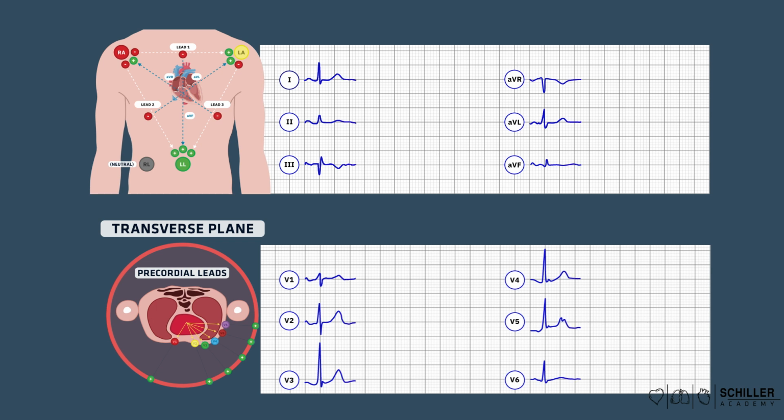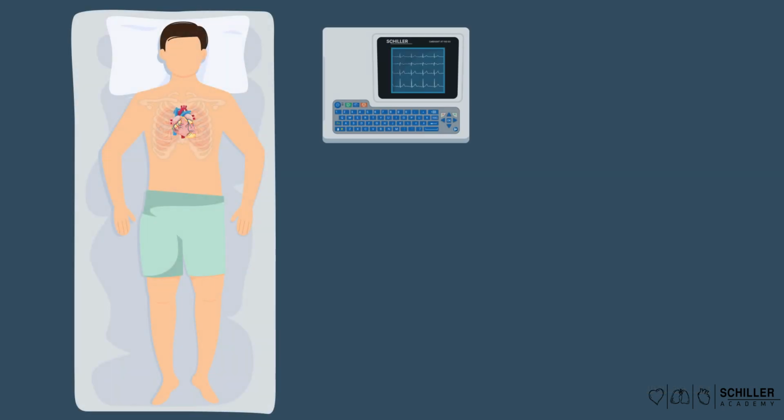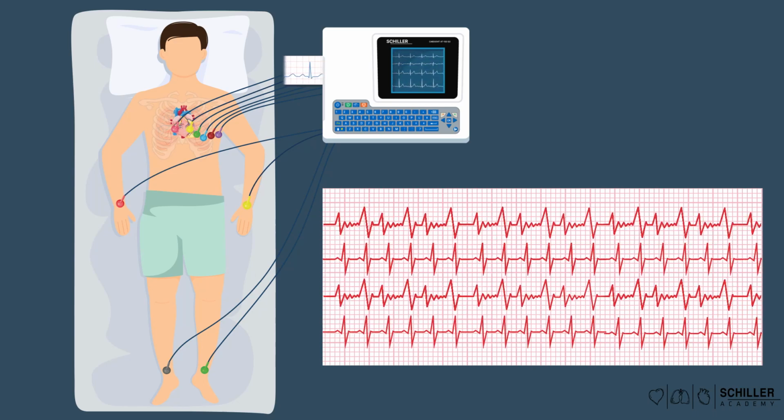The 12 leads of the ECG represent 12 electrical views on a heart from 12 different angles. By means of that, abnormalities in the cardiac activity can be precisely localized. Conducting an ECG is a standard procedure for any cardiac assessment and is indispensable in the medical field.